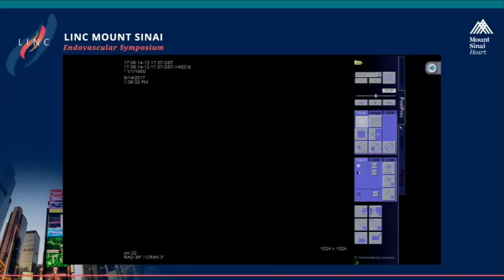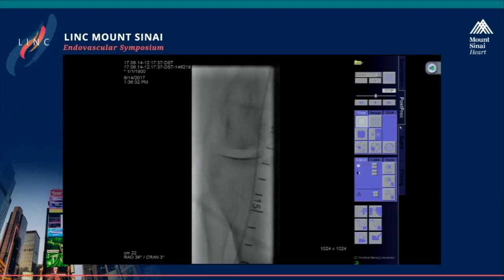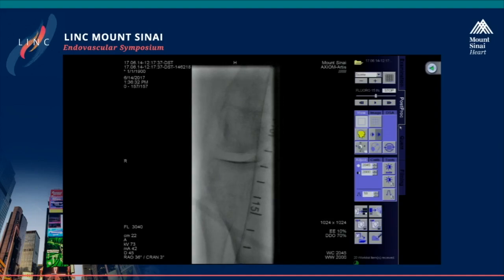Well, we can, but pull the wire. You are already across with a support catheter, which has almost the same outer dimension as a 0.9 millimeter laser. So if laser, then I would use a bigger one, or I would use a Phoenix or whatever kind of atherectomy system here. It does not look so much calcified, so you can use every kind of atherectomy device which is not really dedicated to calcium.